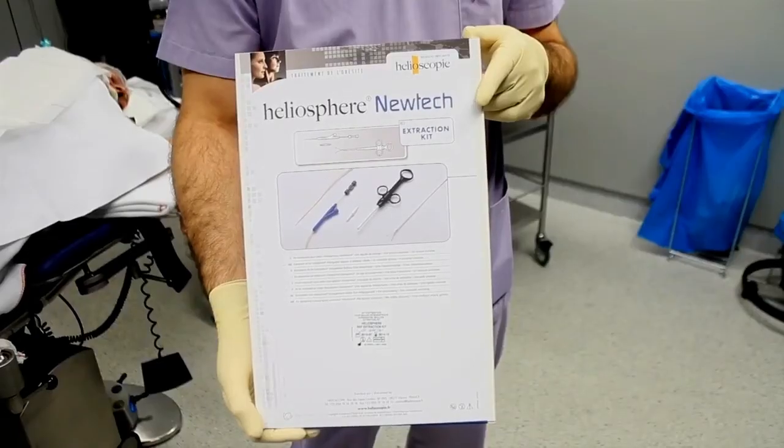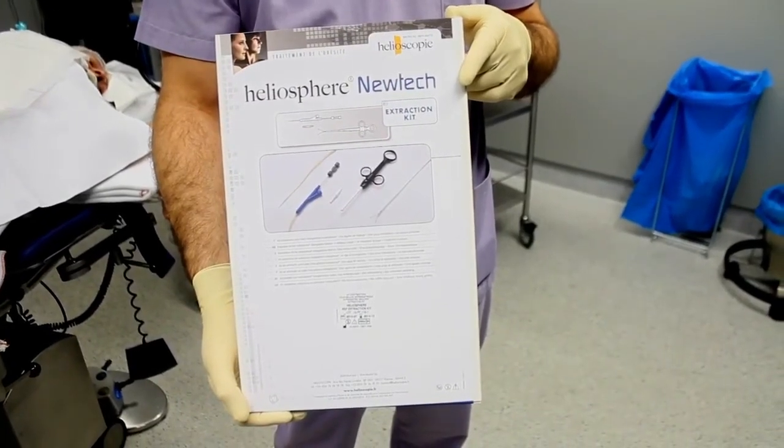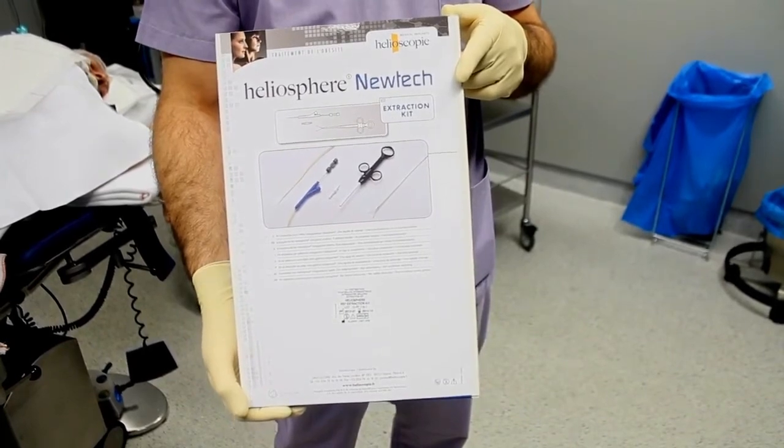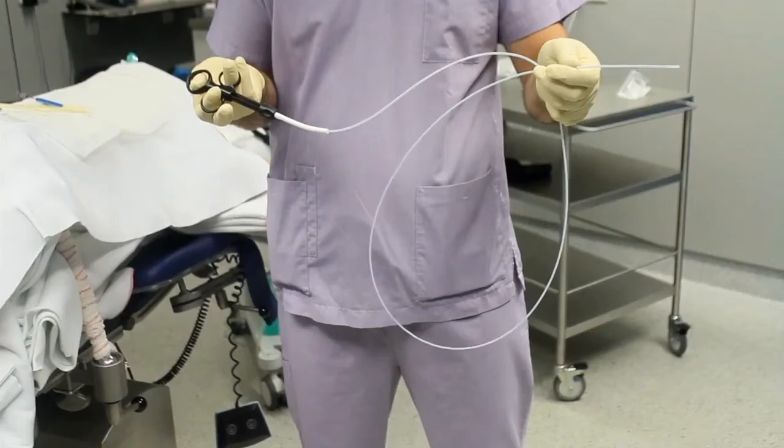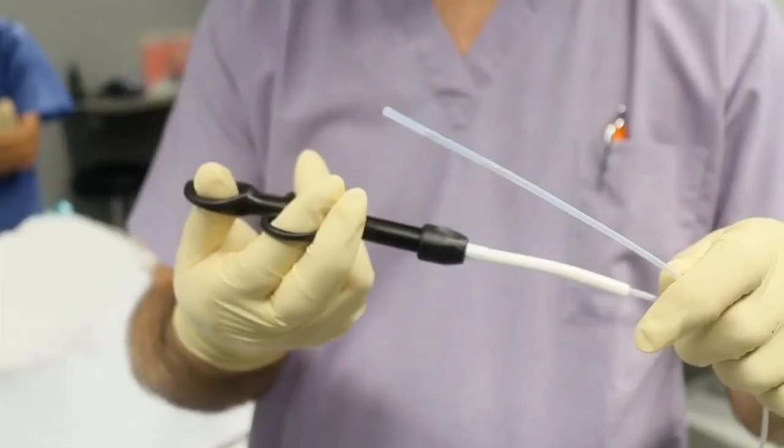Presentation of the extraction kit. This extracting equipment is supplied in sterile packaging and for once-only usage. This kit is made up of a puncture suction catheter and a dedicated dual-grip extraction forceps.